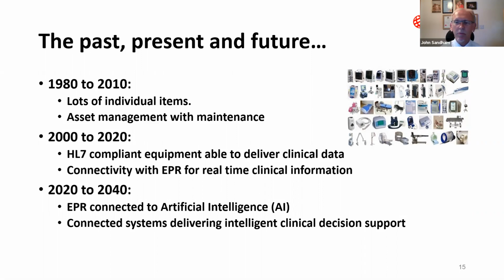Hospitals and other healthcare provider organizations typically have many different computer systems used for everything from billing to patient tracking. All of these systems should communicate with each other or interface when they receive information or when they wish to retrieve information, but at present, not all of them do. HL7 defines a series of electronic messages to support administrative, logistical, financial, as well as clinical processes.